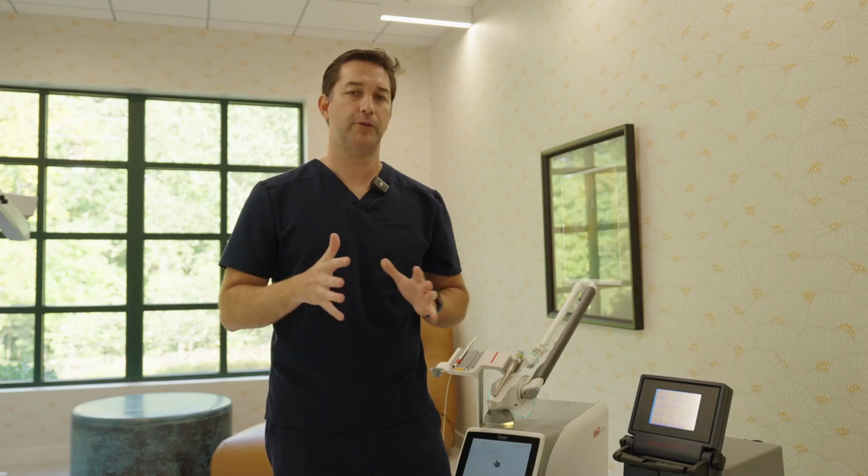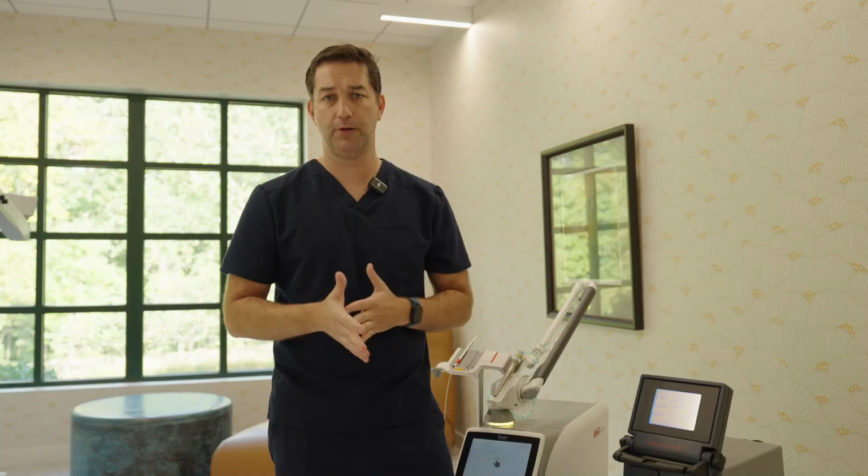We use LANAP most of the time for patients that have moderate to severe periodontal disease. It can be used for any periodontal disease severity, but I feel like the best results are when you use it for patients with moderate to severe disease. Those are the cases where most of the time I have to go surgical, but using LANAP as the first therapy, what I found is that the level of surgery that I provide to patients later is a lot less. So basically we can reduce the amount of surgery that is necessary to control periodontal disease by using this machine and give patients a much better result that we sometimes cannot even achieve with periodontal surgery.